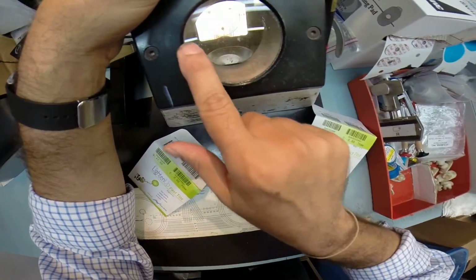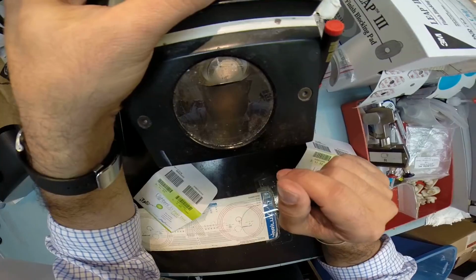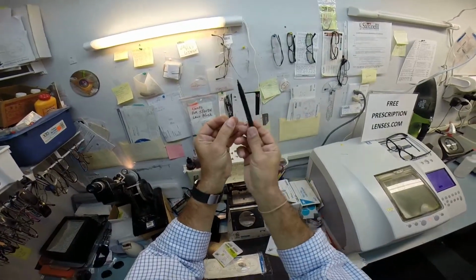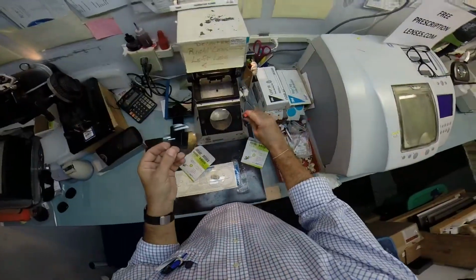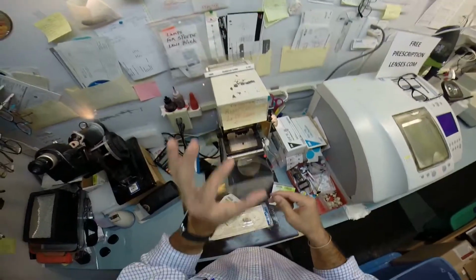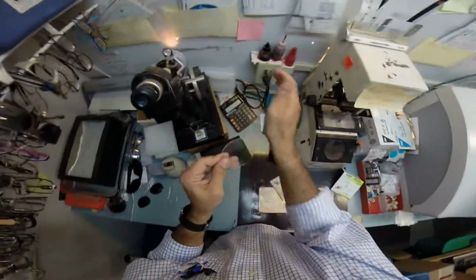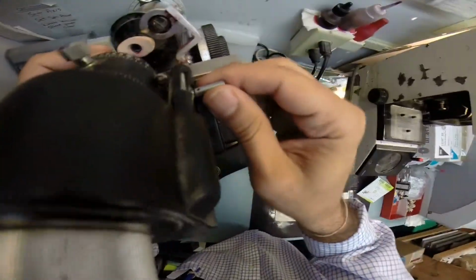I've got a vertical meridian and a horizontal one, and I want to get those 3 dots lined up perfectly on the horizontal meridian. And then the vertical one is going to go right through your optical center. So let's do the same thing now. Get all that dust off the lens. Where'd all that come from? Oops, look. Okay, let me put some more red dots on there.